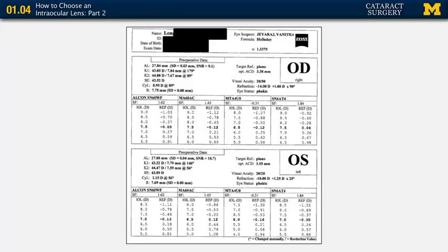And still starting off with our first step, identifying the patient's data. We start with patient name, correct patient name, correct eye, laterality check. And here we see that the axial length does make sense, at a 27.84 millimeter eye. That does hold true with what we were saying before. Our next step here is testing the quality of the study.